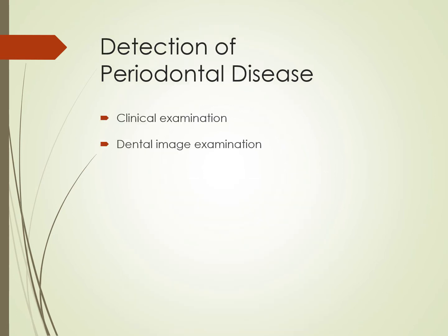Okay, so in the detection of periodontal disease, not just the description, but the detection, we need both things: a clinical examination and a dental image examination. One without the other is not a full diagnosis. It's not a full detection of periodontal disease, okay?